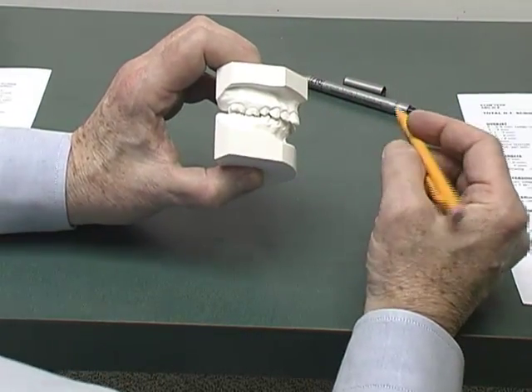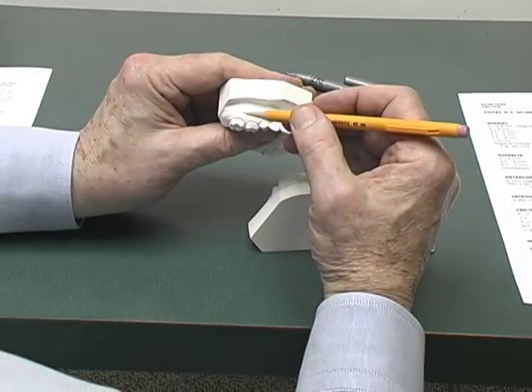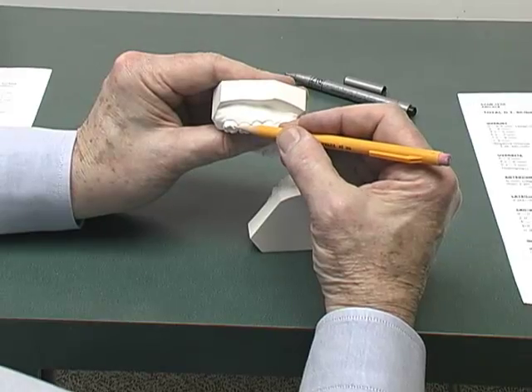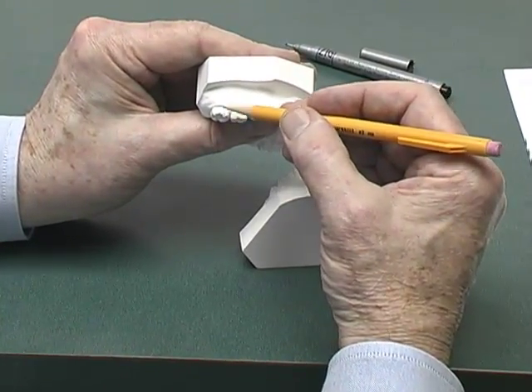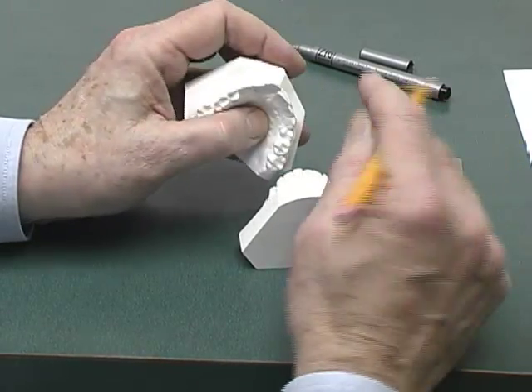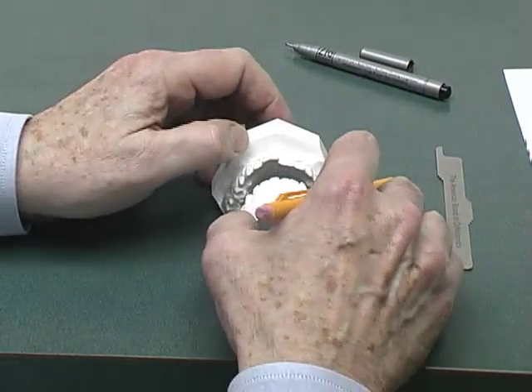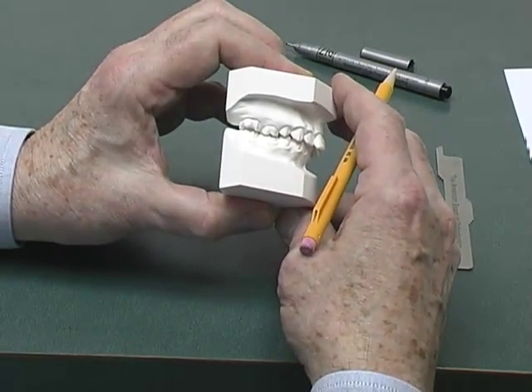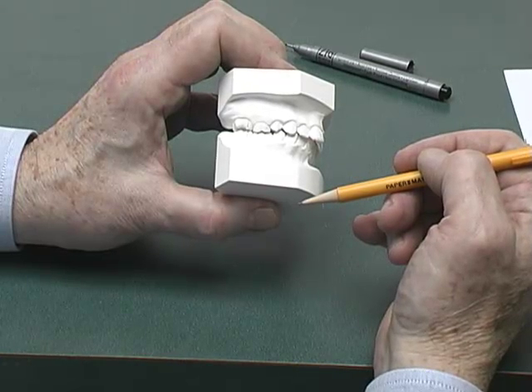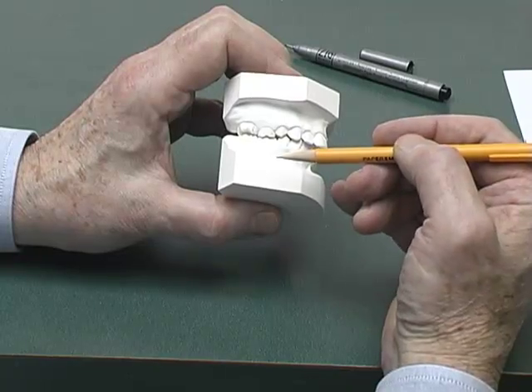When we look at the right side first molars, it looks like they are end-to-end. I will separate the casts and mark the height of contour of the mesial buccal cusp of the maxillary first molar. Even though this cusp tip is not worn off, sometimes a cusp tip will be worn off and it is helpful to draw that line to imagine where the cusp tip would have been. Then I pick up the mandibular cast and mark the height of the mesial buccal cusp of the mandibular first molar. Placing the casts on their backs, the lines are essentially on top of one another — the mandibular cusp line is even with the maxillary first molar line — so two points would be scored in this situation.